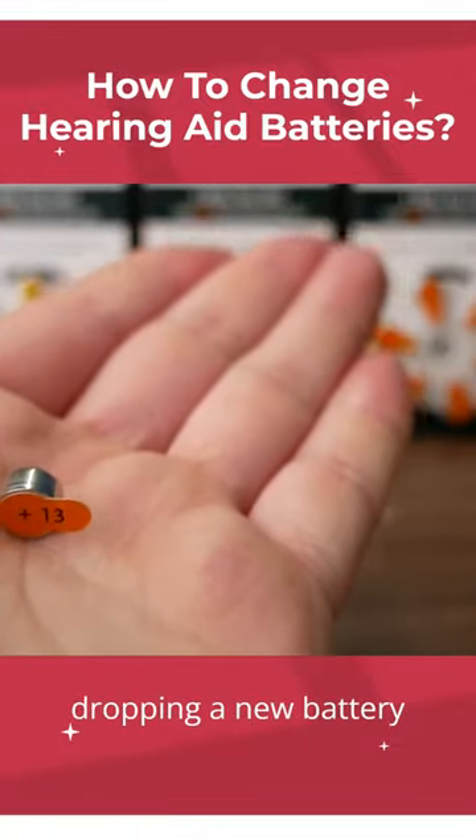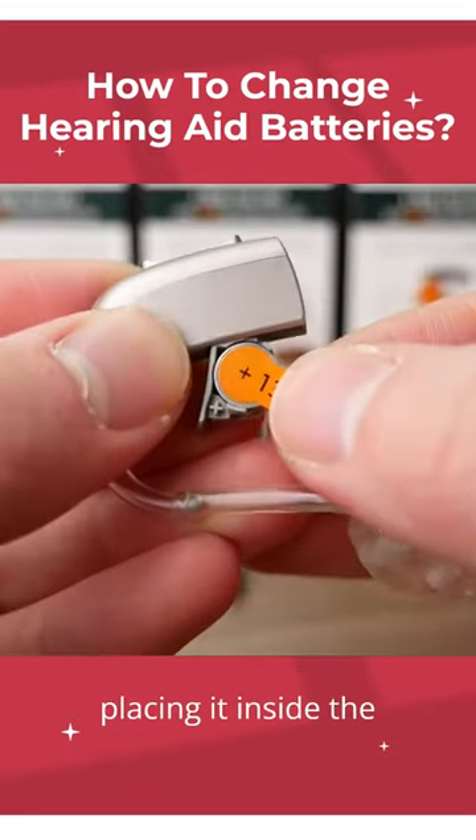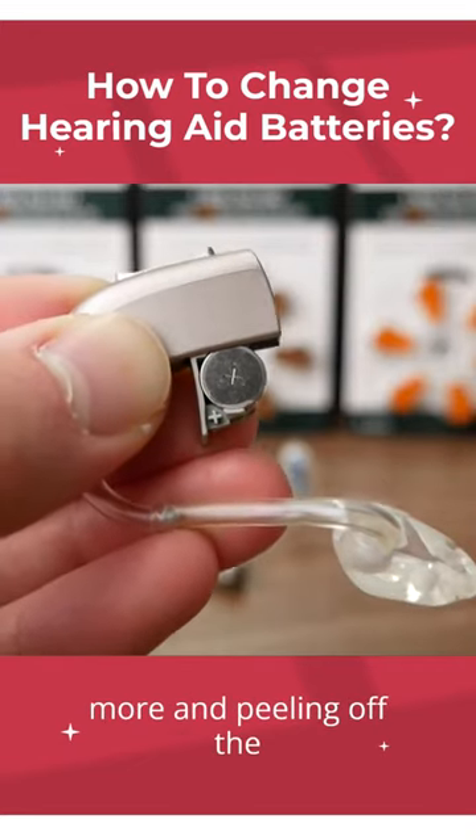Dropping a new battery out, placing it inside the compartment, closing it a little bit more, and peeling off the sticker.